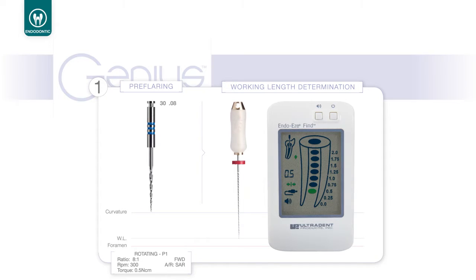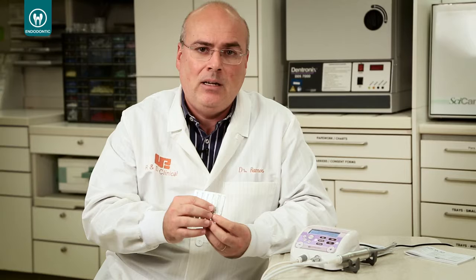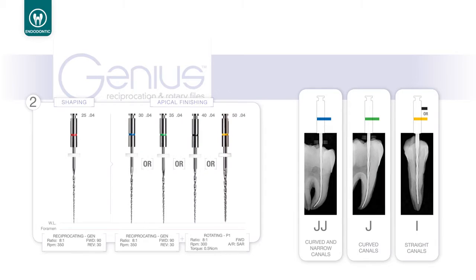After pre-flaring with the orifice shaper, we will use the 25.04 file, the red one, first until the working length, to open space in reciprocation. In this way, you increase the safety of the procedure. After that, you choose one of the final files based on the diameter of the file and the anatomy of the canal. Let's say that you are doing a mesial root of a lower molar, a mesial buccal canal, for example. Then we can choose the 35.04.